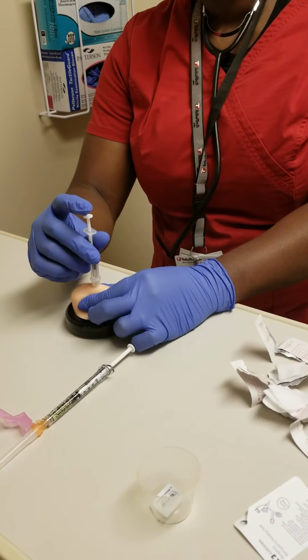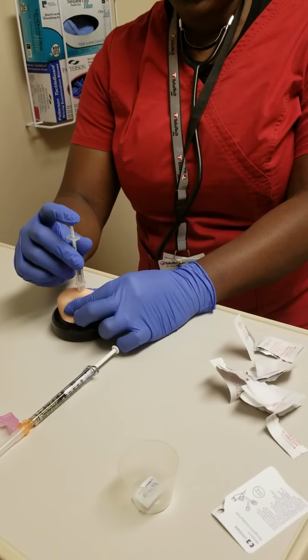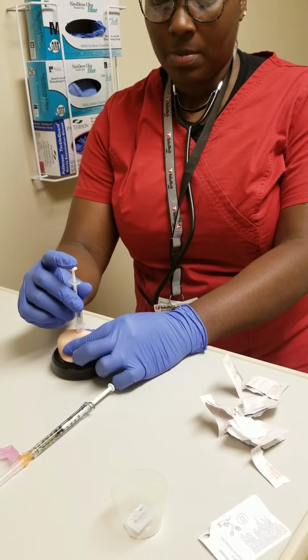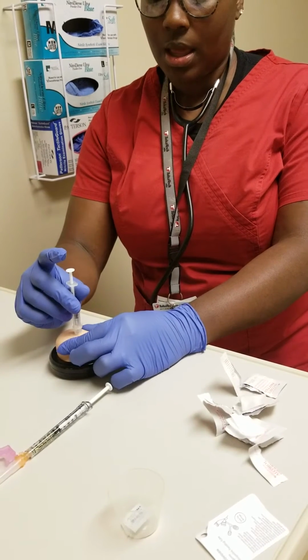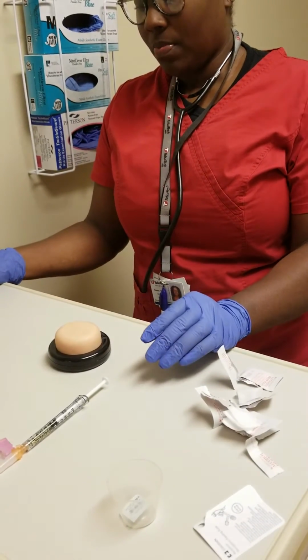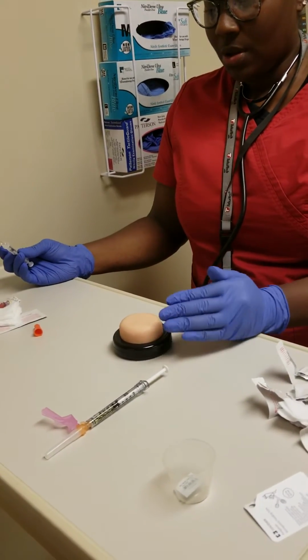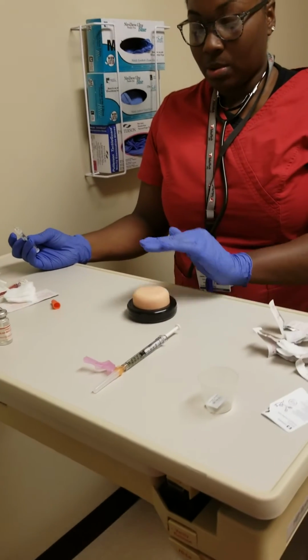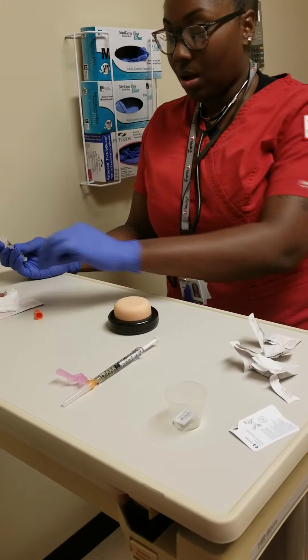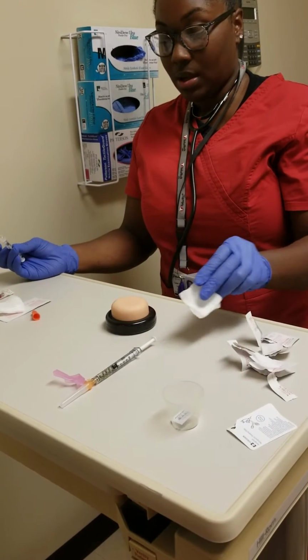I'm not going to inject inside the little fatty skin we have, but I would inject the entire units inside of the area on the abdomen. Well, actually, I would poke it in, let go, and inject. Then I will draw out. There's no bleeding, so I don't have to put a Band-Aid or anything like that. I will just make sure that the area is absorbed correctly, so I will place a gauze on the area and just hold it down a little bit. That's it. I will throw that away.